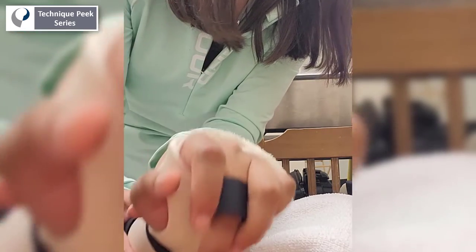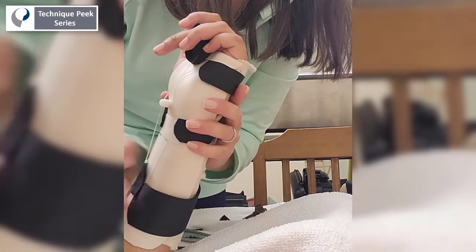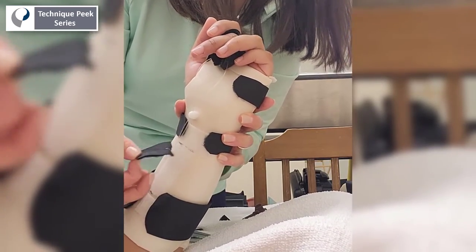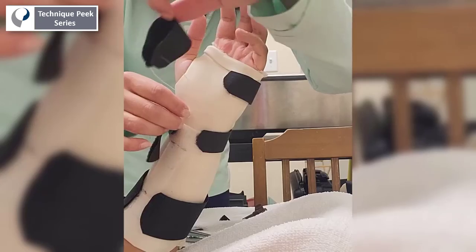An initial wearing schedule for a splint of this type might be anywhere from 5 to 15 minutes, three to five times a day to achieve maximal gains in range of motion. Thank you, and I hope this was helpful.